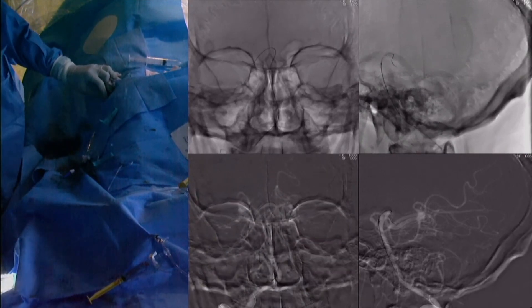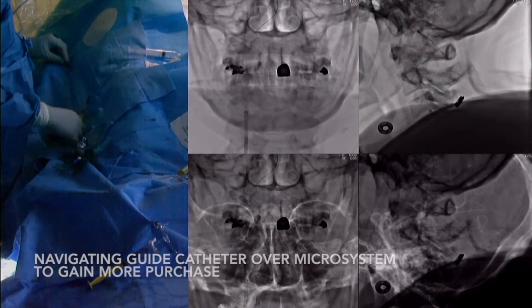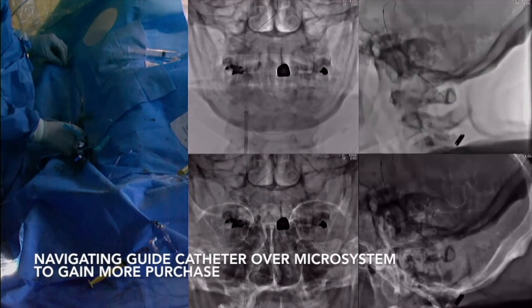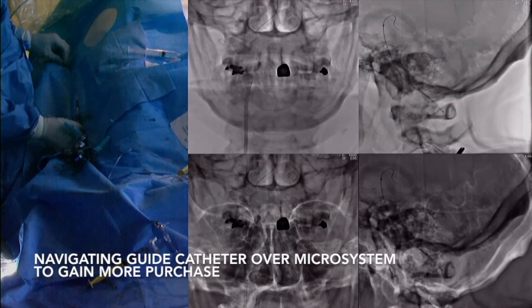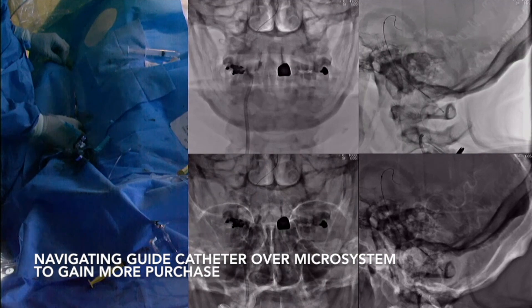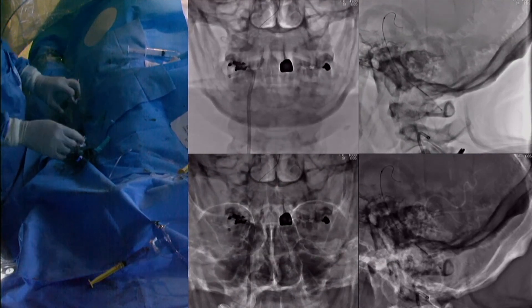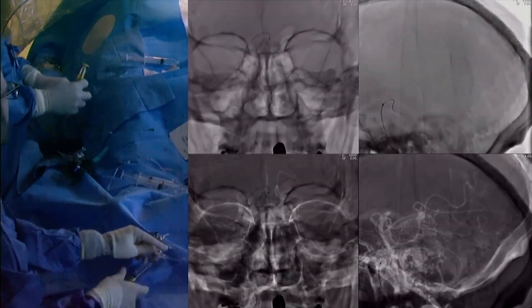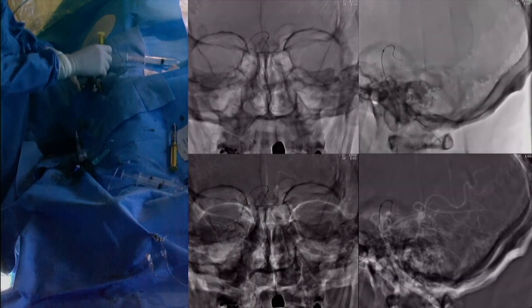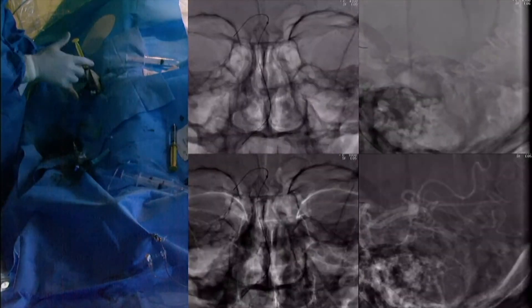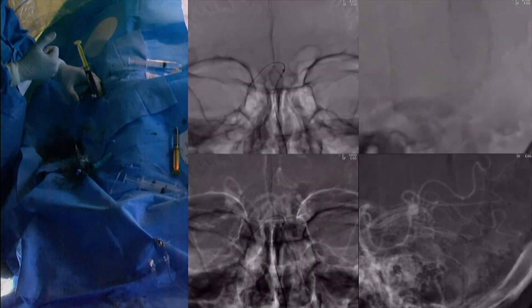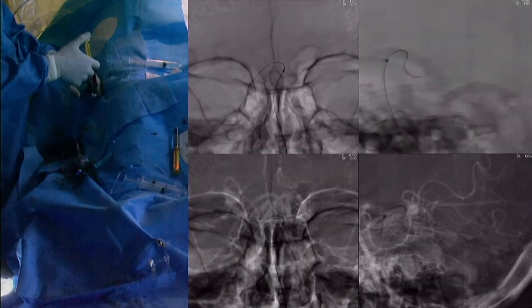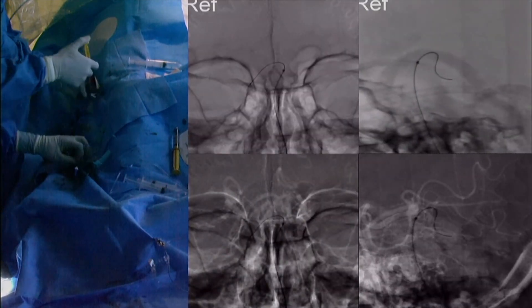Here we can be seen advancing the guide catheter into a more distal position for more stability in preparation to deploy a flow diverter. While the wire did not feel right, at this point we obtain new images to confirm we are in the correct place.